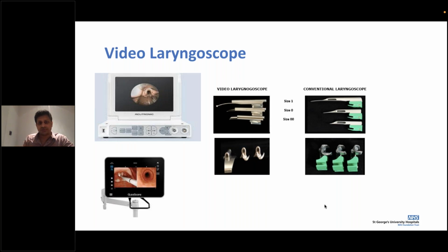So it's much easier for you to visualize. And once you've had a good vision, then either passing a LISA catheter or an endotracheal tube becomes easy. It's a technique of advancing. Once you have seen the vocal cord, you pass your endotracheal tube closer to the vocal cord, and sometimes you may need to maneuver ever so slightly in such a way that the tip then enters the vocal cords, and then advance further. So it's a technique that you have to teach yourself, whether it's conventional or video laryngoscope.